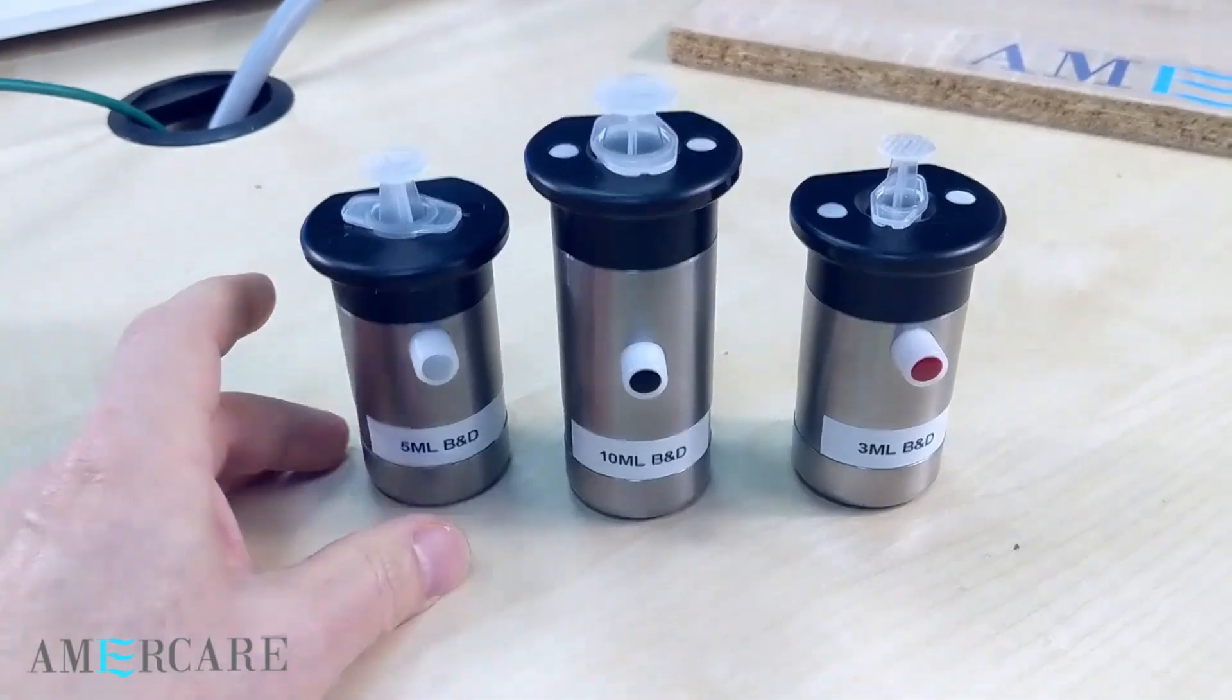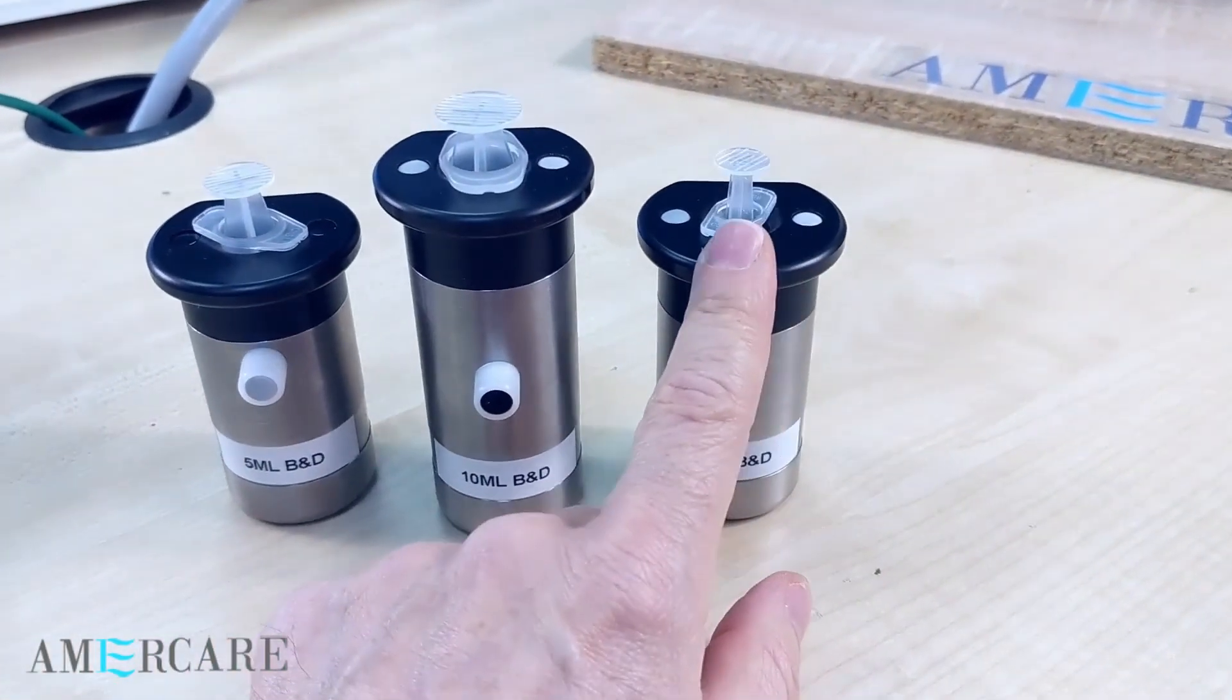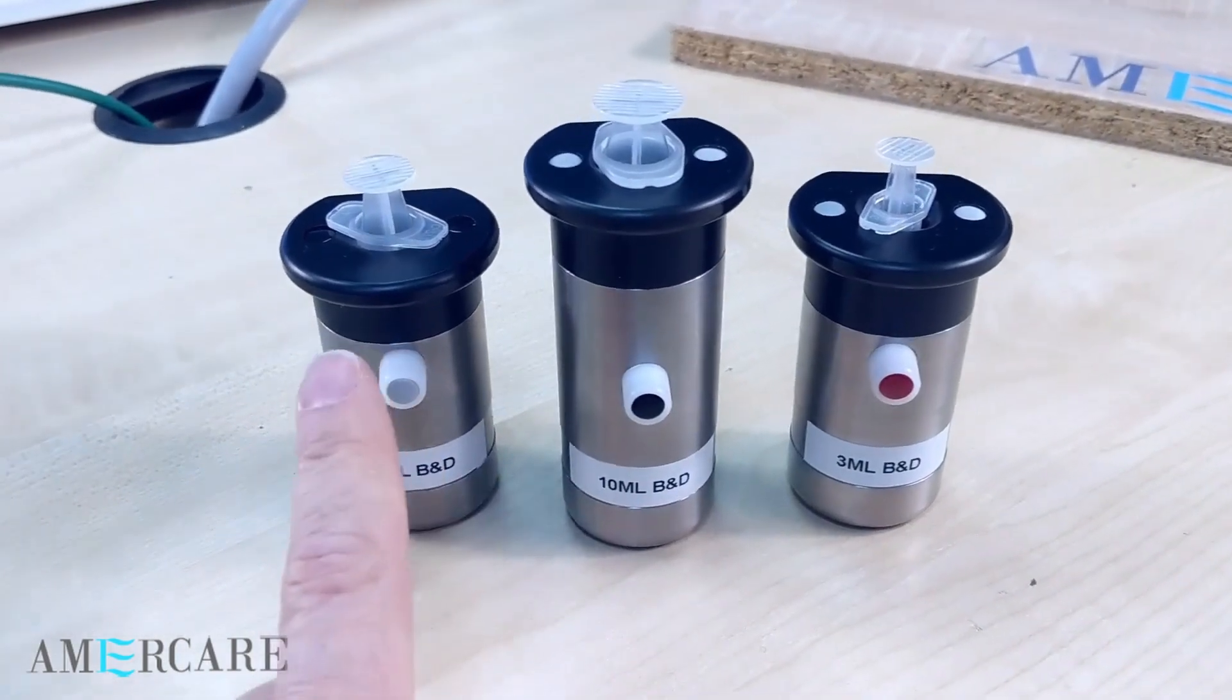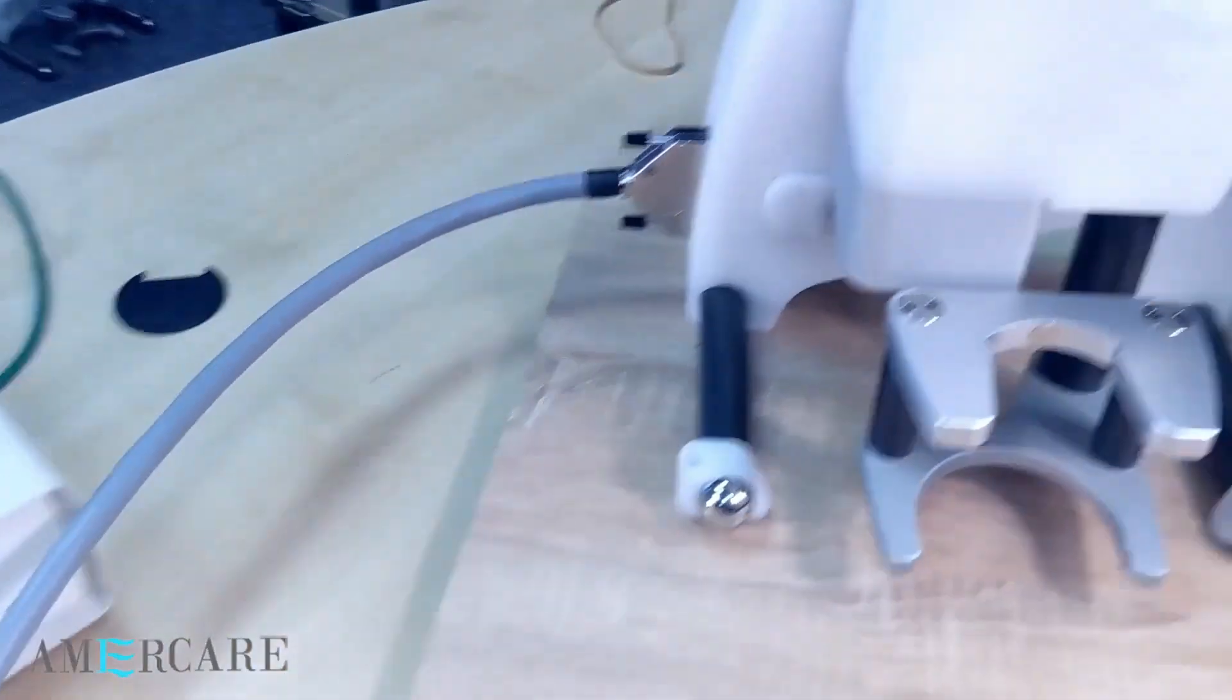The syringe shields shown here are for a 5ml B&D, a 10ml B&D and a 3ml B&D. The front of each shield is fitted with a colored cap. This relates to the dial on the top of the unit.